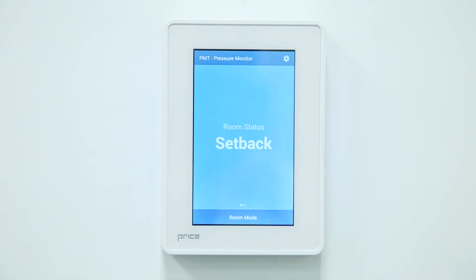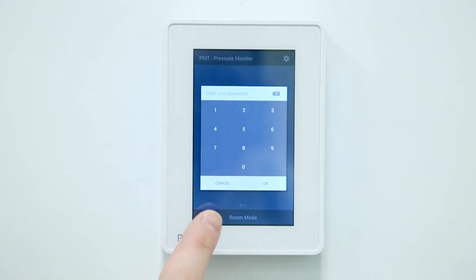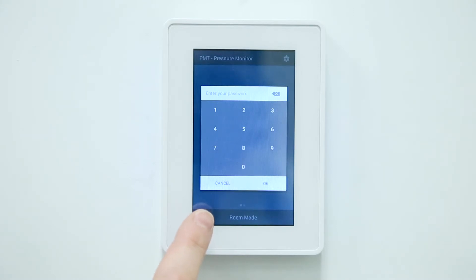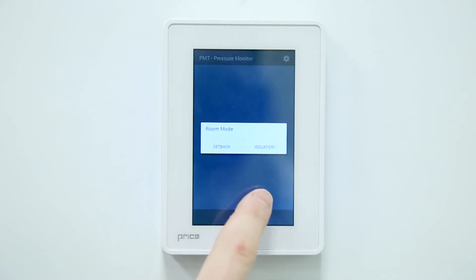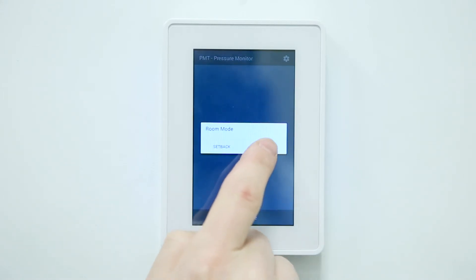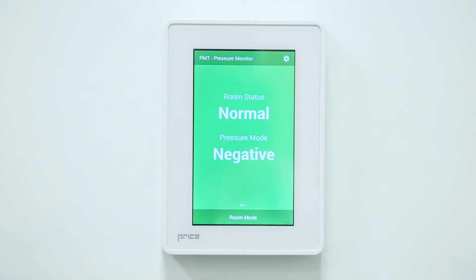To change the room mode back to isolation, touch the room mode bar along the bottom of the PMT. This will bring up the password protection popup again. At this time, re-enter the password. After entering the password, select OK and then select isolation and the unit will go back into isolation mode. Both the screen text and color have changed to indicate isolation mode.